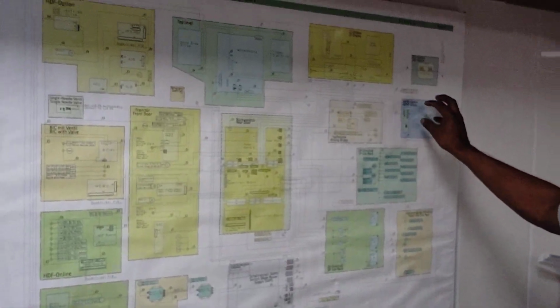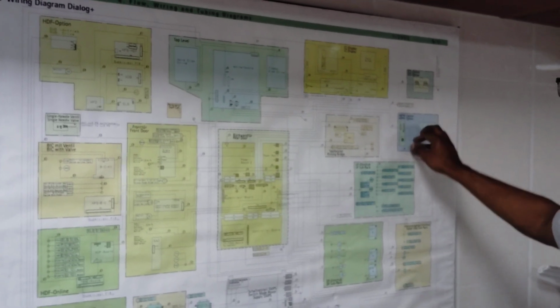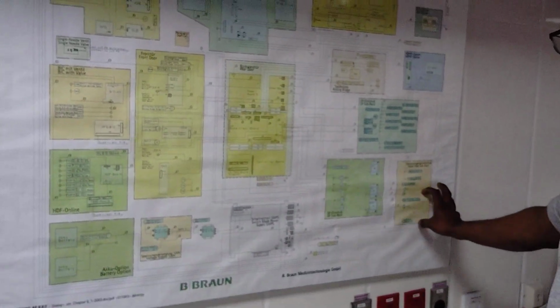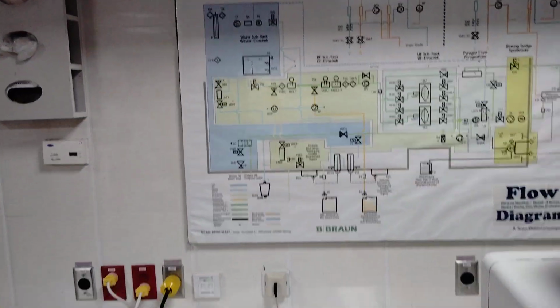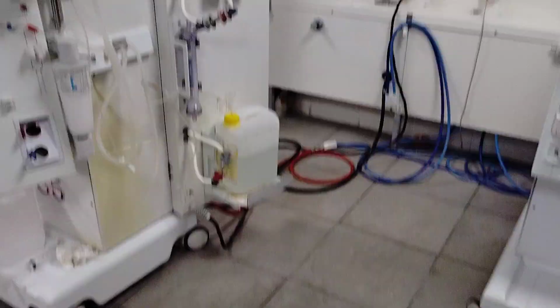And this is the ABPM module, so the BP module is there. For the internet cable, DCI, and some other supports are there. So this is our wiring diagram, and batteries also. Of course, there is a backup battery in the machines, placed in the machine.